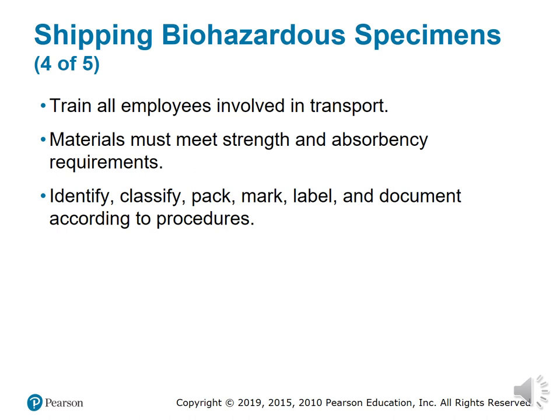They had their own little centrifuge where they would spin whatever tubes needed to be spun. They were separated, allocated out, frozen if needed to be frozen, protected from light if needed to be protected from light. They would mark it, categorize it, document it, pack it, ship it out, and send it off to the appropriate lab where it needed to be. That was their responsibility.